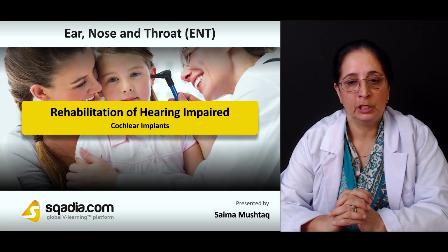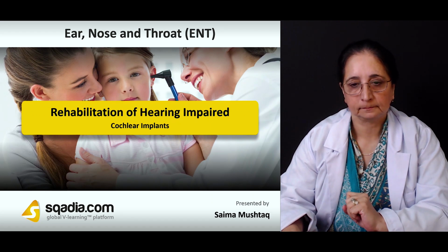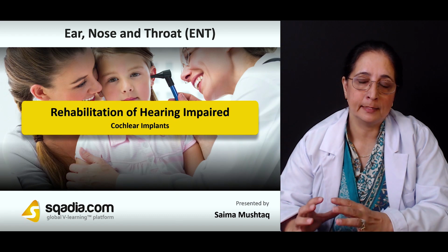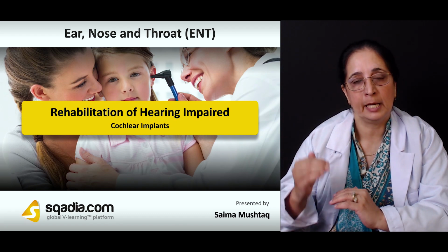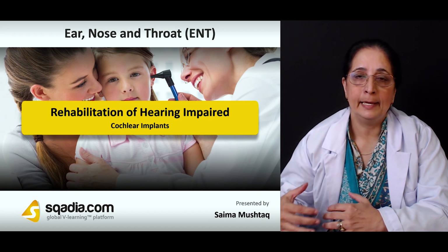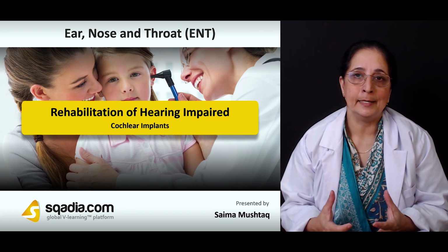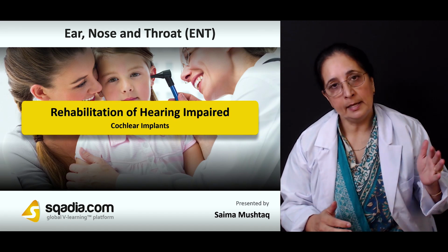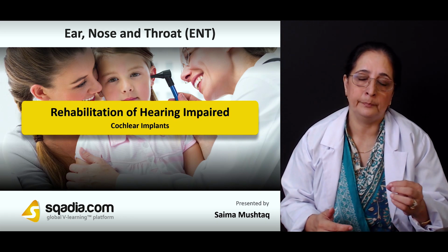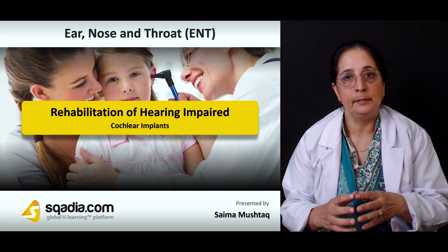In the fourth section, now we will talk about the cochlear implants. The cochlea is in the inner ear, and that's the final step from where the sound goes to the auditory nerve in the normal hearing individual. So once the implant is in the cochlea, then it bypasses all these steps of the passing of the sound from the external ear, then the middle ear.